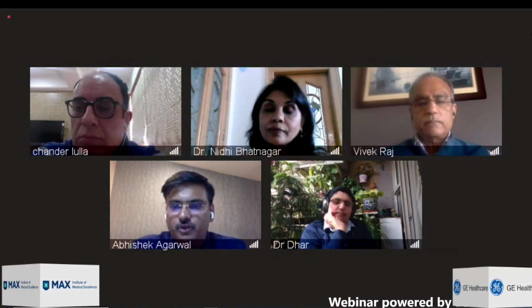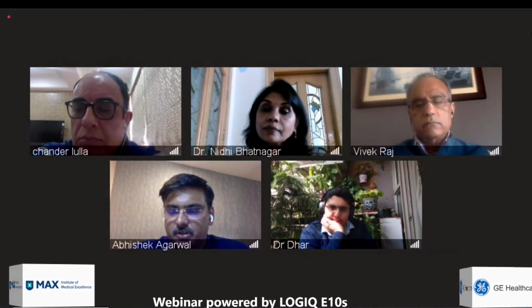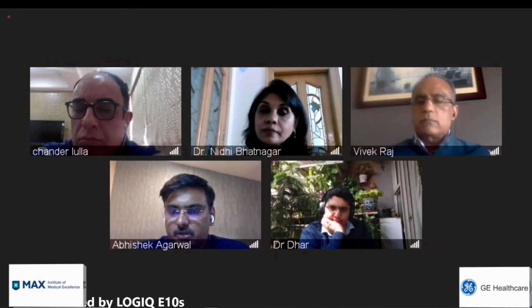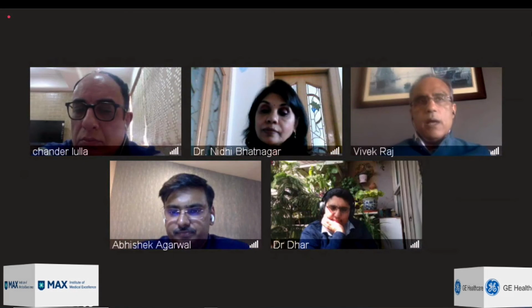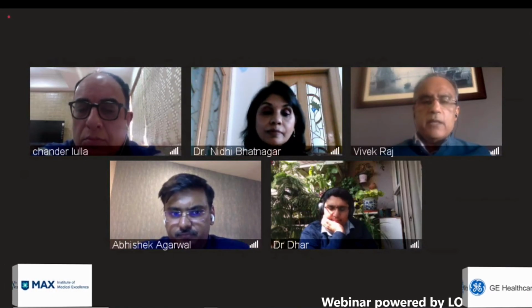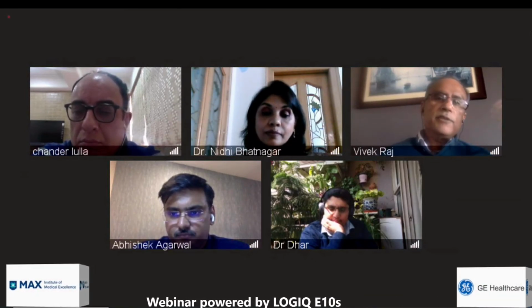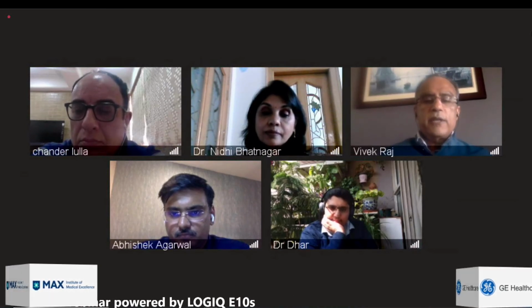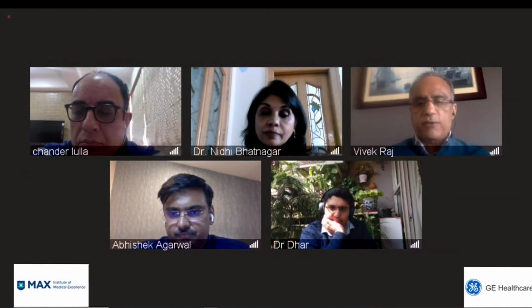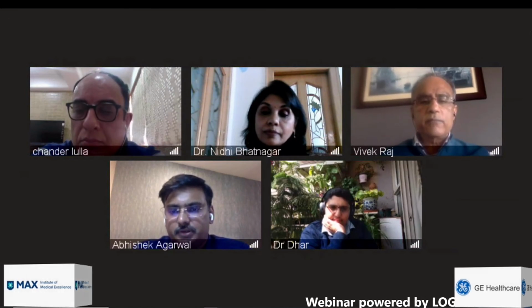Is there a general rule for how frequently the surveillance should be done with ultrasound or elastography in a patient with viral or alcohol-induced hepatitis on management? I don't think there are specific guidelines for that. Dr. Dhar might correct me, but I think we are using what we learned from management of cirrhosis and HCC screening, for example, or the rate of improvement. My personal practice is roughly about a year if I'm just doing a regular assessment, but I don't think there are specific guidelines whether we should be using it more or less frequently.